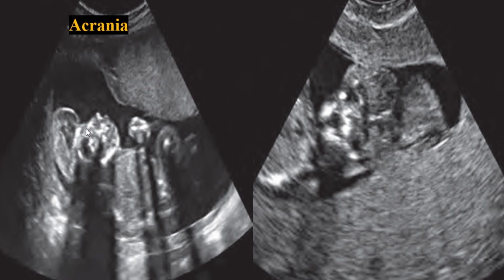Here we can see the parasagittal view of the fetus with acrania, and it shows the absence of calvarium above the level of the orbits, and a large amount of dysmorphic tissue resembling brain tissue is seen above the orbits. And here we can see the coronal view of the head of the fetus, and it demonstrates a large amount of soft tissue resembling brain tissue extending superiorly and laterally above the orbits in a configuration that has been likened to the head and ears of the Mickey Mouse sign.